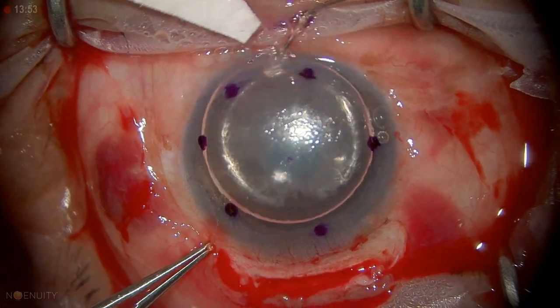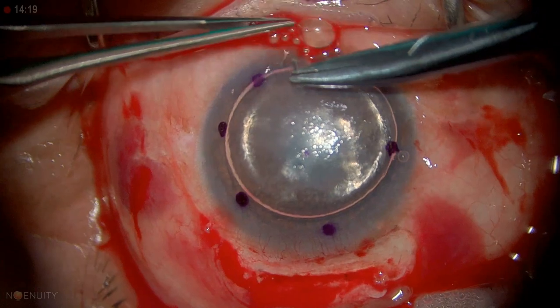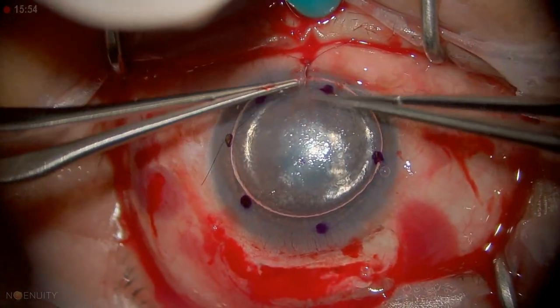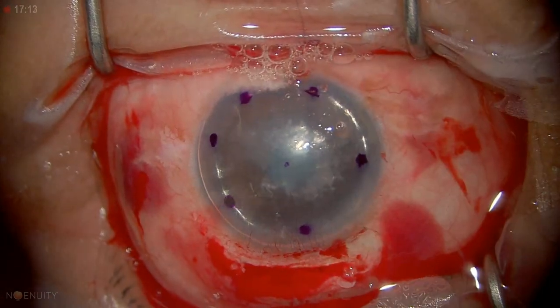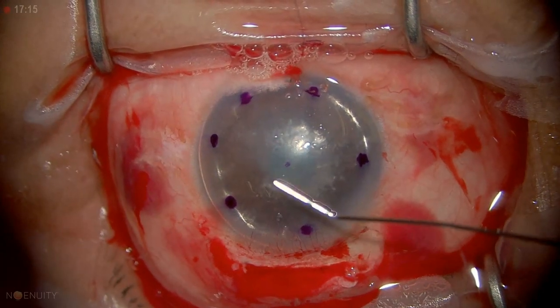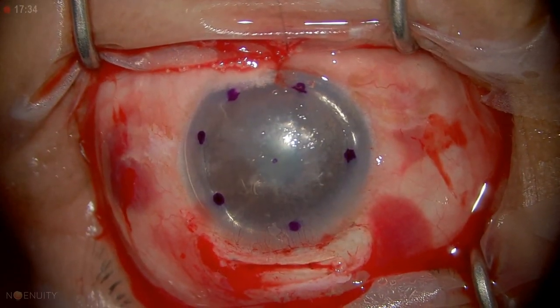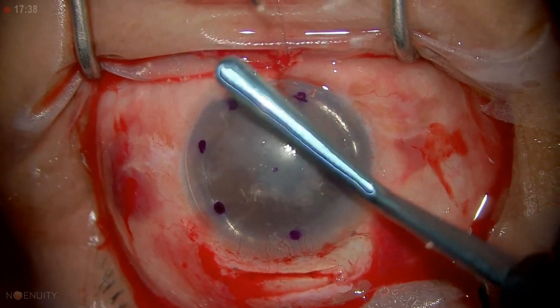We now have a bubble. The bubble wants to escape, so I need to put a suture through that so it stays closed. Now we need to fill that air bubble completely. We're pretty firm now. I'll take the Morlet spatula back and we're going to put some viscoelastic on it, which helps to keep it smooth.